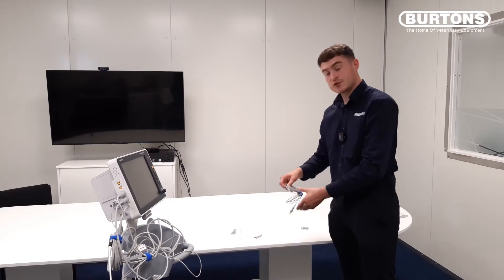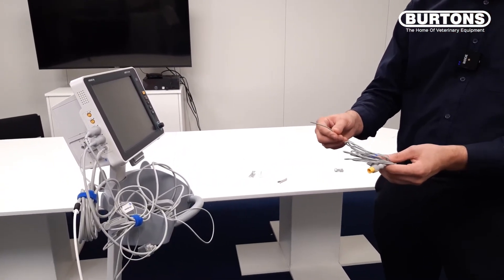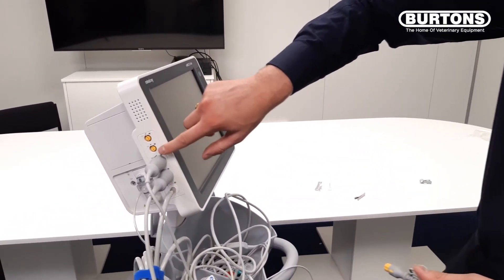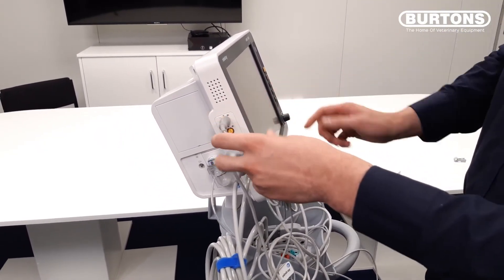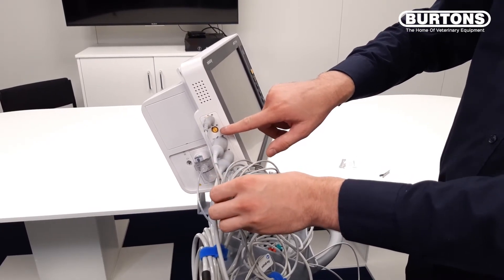This is the temperature probe. You can use this esophageal or rectal, and as you can see on the monitor there are two temperature ports. I would advise using T1, and you can also use a second probe if you wanted to do a temperature differential.